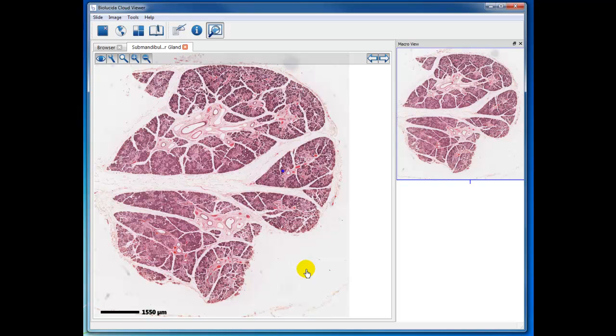The pancreas also has a contribution to digestion of glycogen, starch, things like that, but that's of course in the abdominal cavity. And the pancreas has an endocrine component. So that will be another specimen in this module. But right now, let's look at this submandibular gland.